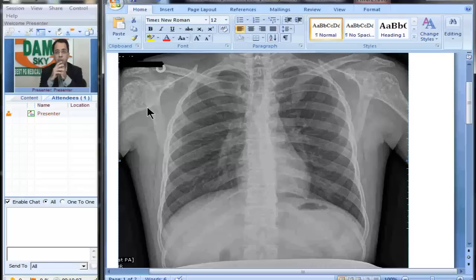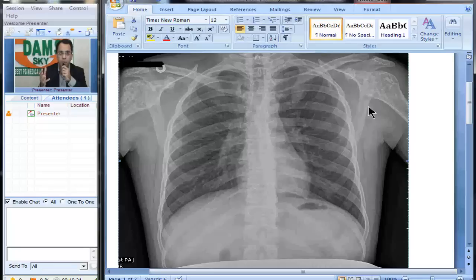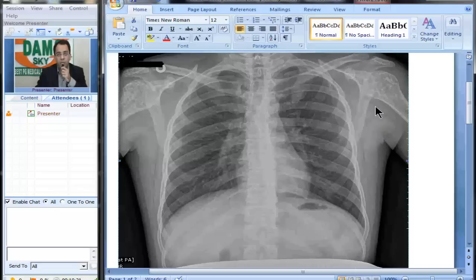Can you give me the diagnosis? This is called osteopoikilosis. Osteopoikilosis is also called the spotted bone disease. It is a benign process, but the important thing is to differentiate it from other sinister things which may look similar — for example, osteoblastic metastasis. Osteopoikilosis is always clustered around the joints, and the long axis of the sclerotic foci are along the long axis of the bone. So this tells us this is a benign thing, nothing to worry about.